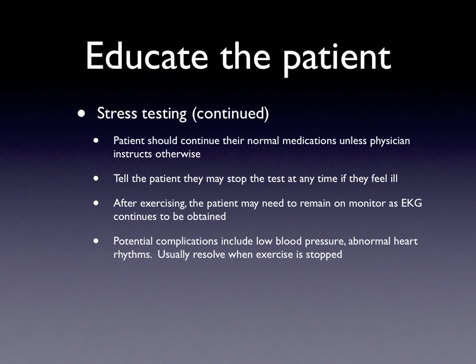Potential complications during stress testing can include low blood pressure and abnormal heart rhythms, and these should usually resolve when the exercise is stopped. Obviously, if you feel uncomfortable about the situation, you should go ahead and call for assistance.